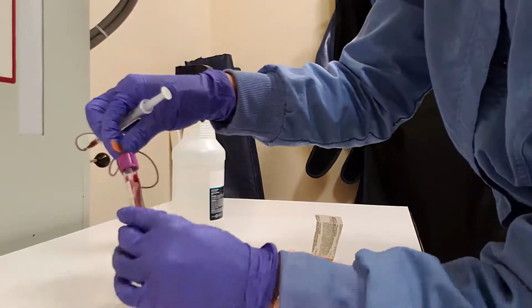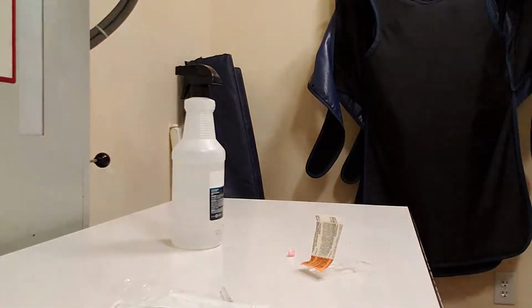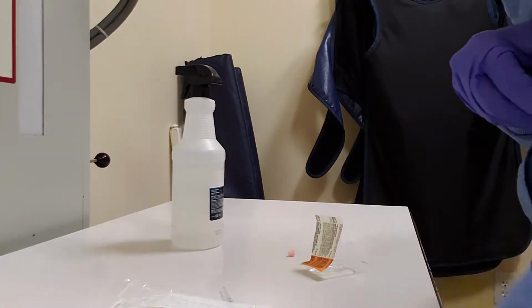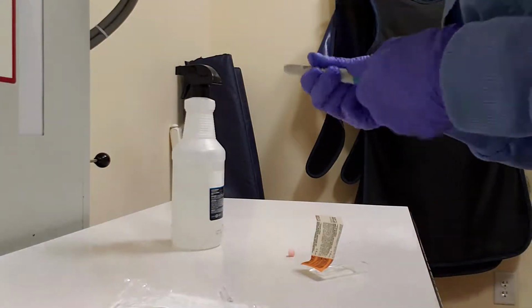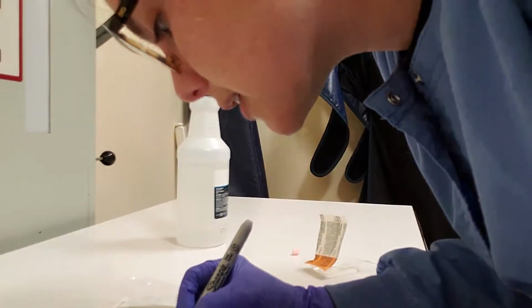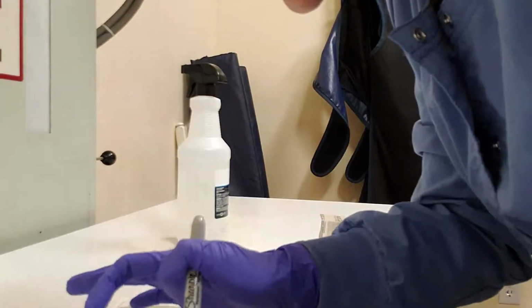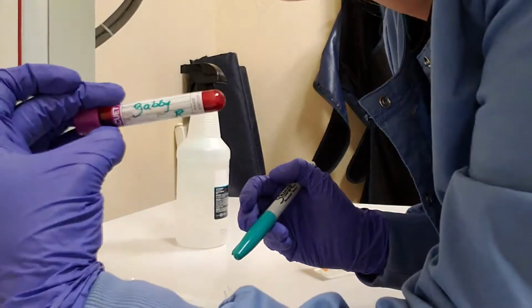All good. All right, so now that we have our blood, we want to invert it. And we will label our tube, and we'll make sure that we label it with her name and that she is our recipient. So I'll put a big R on there for recipient.